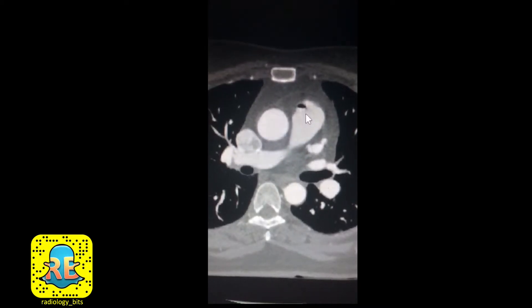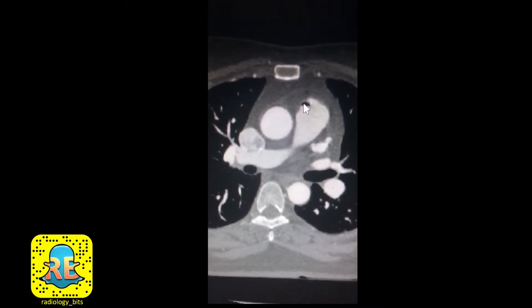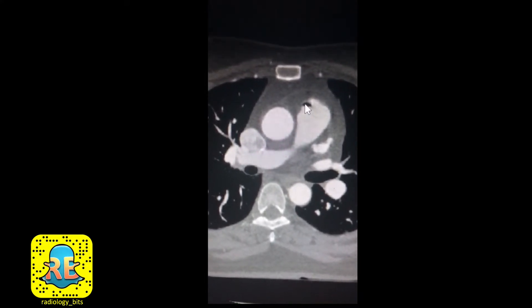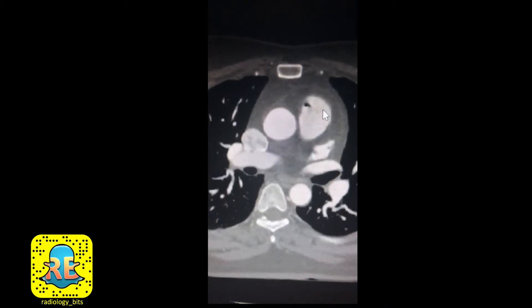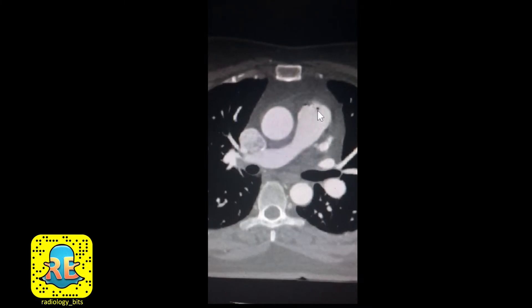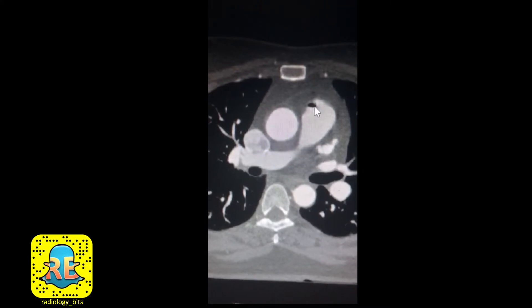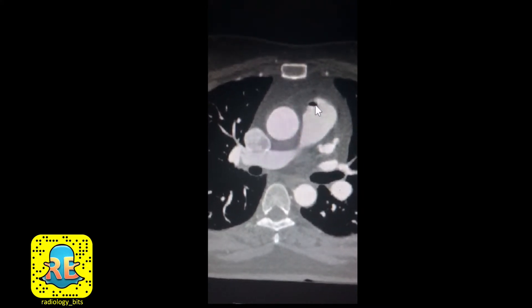Now this is what catches your attention as a junior radiology resident if you see it for the first time. You see this dark spot here within the pulmonary artery — there's another dark spot here as well. And you know that these are air density, so you're totally concerned about having air within the pulmonary artery.